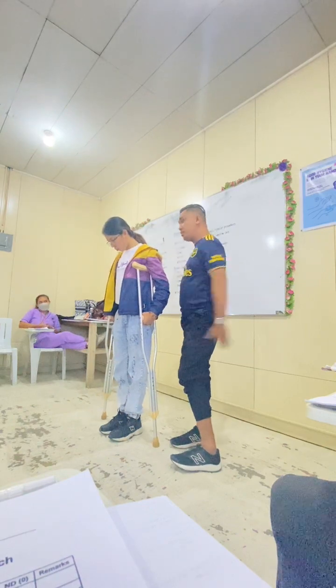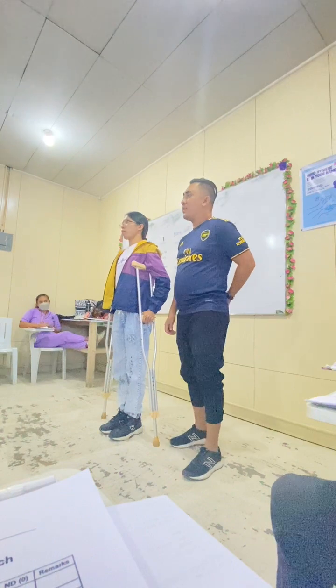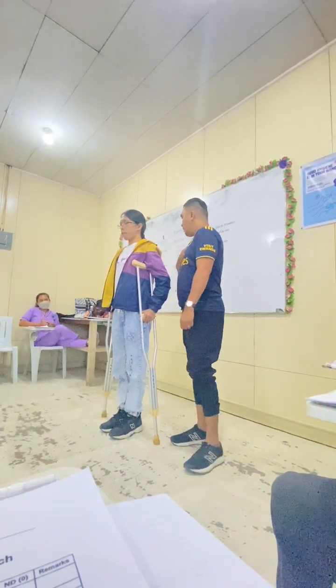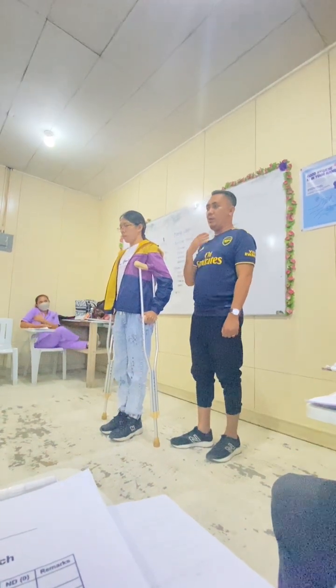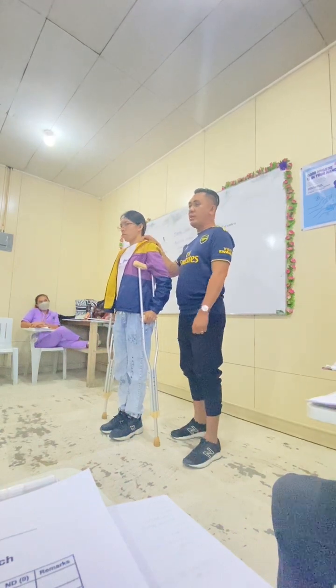For there will be space for movement. Pwede. Unsa pa? Muscle strength. Grip. Dili ang grip. Sakit ang ilong sa patient. Armpit. Okay. So I'll rephrase your answer this year.